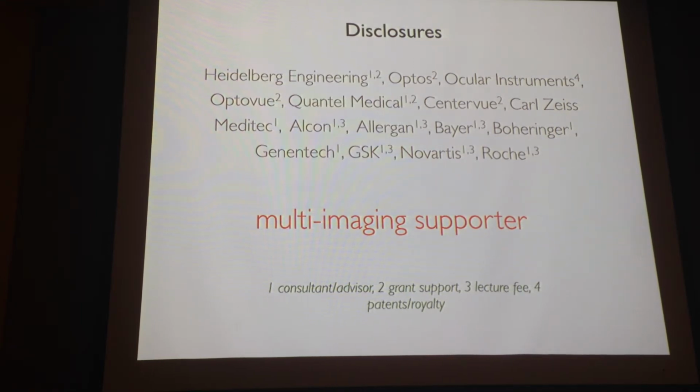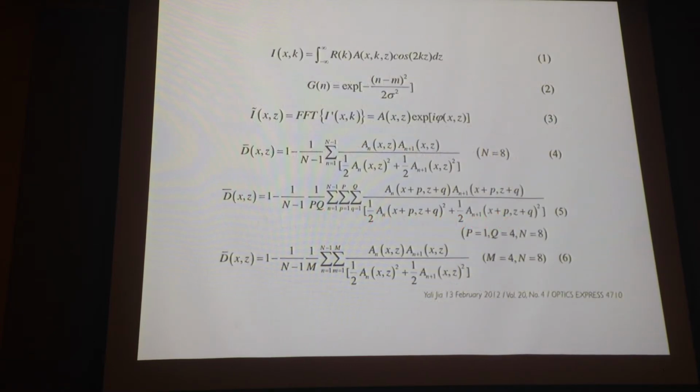Now, how many of you are using OCT angiography right now? Yes. So not so many. So I will try to explain. So this is the angiography.